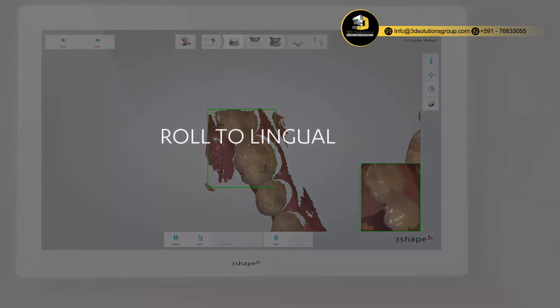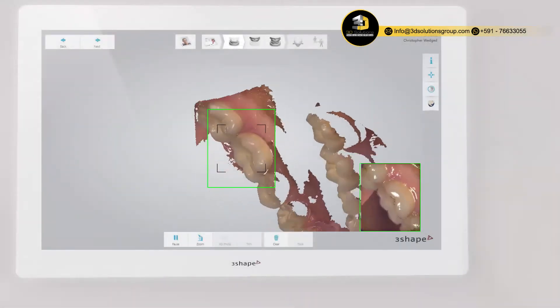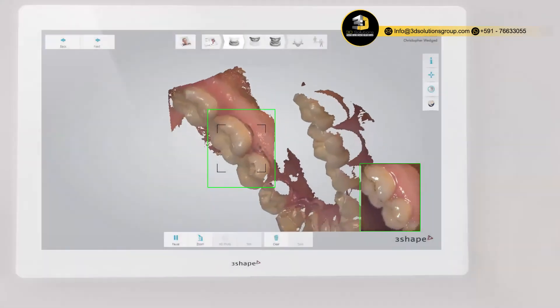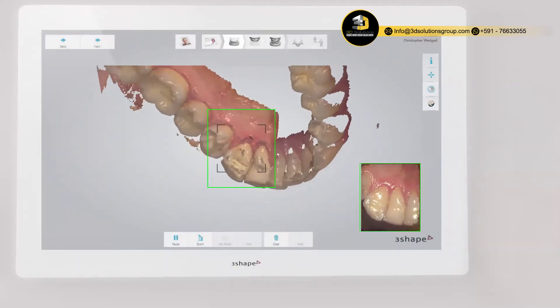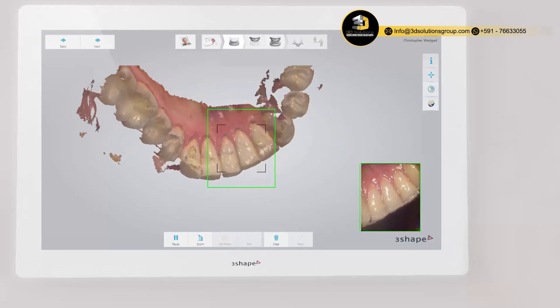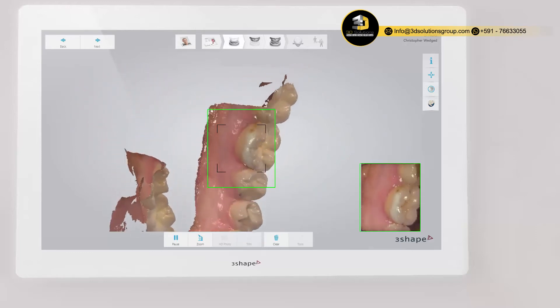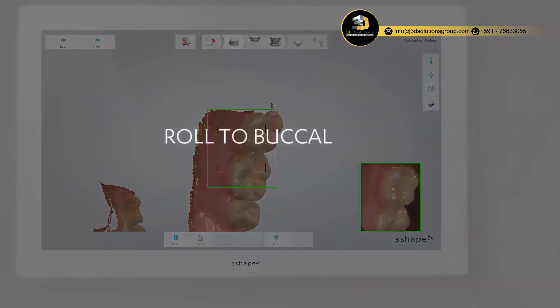When you reach the last molar, turn slowly lingual, taking care firstly of areas where soft tissue may interfere with the scan. Roll the scanner 60 to 90 degrees to the lingual side and use the tip to keep the tongue away.